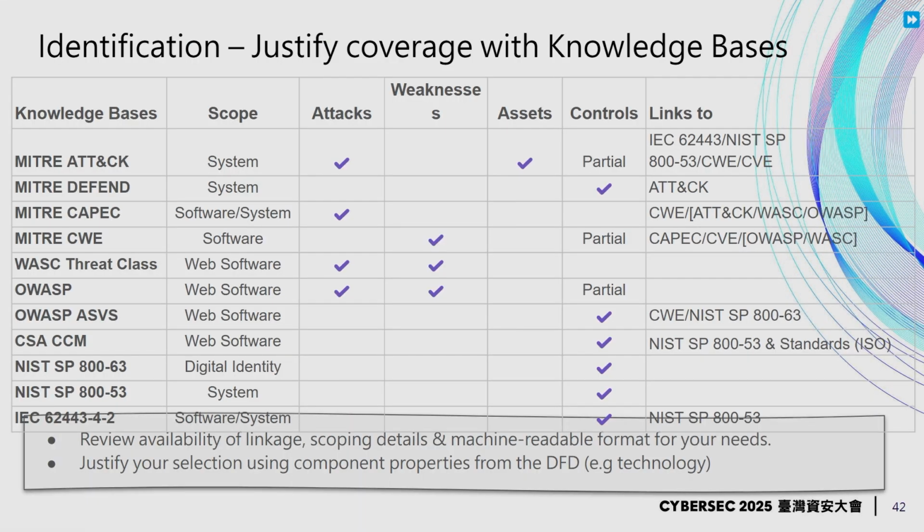All right. Now we need to build this defensible list of security risks. And the key element to help us is the industry knowledge base, typically the ones from MITRE, OWASP, NIST, and so on, that provide a market-vetted list of threats, especially those built from real-life observation, like the CVEs, and that's mostly the case of the MITRE ones, the MITRE CWE or the MITRE ATT&CK.